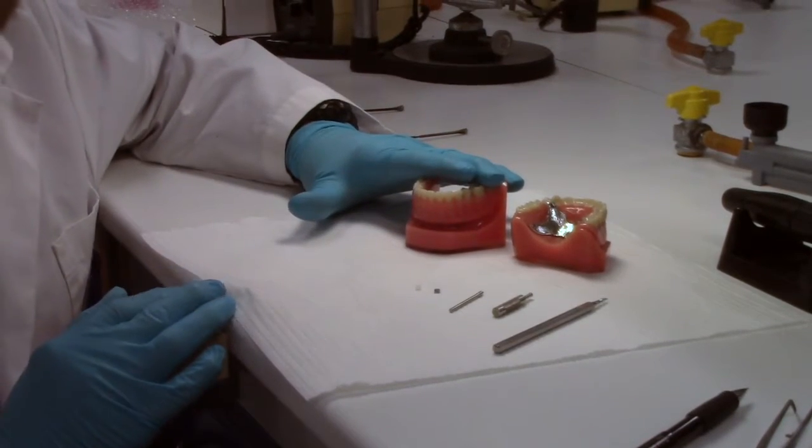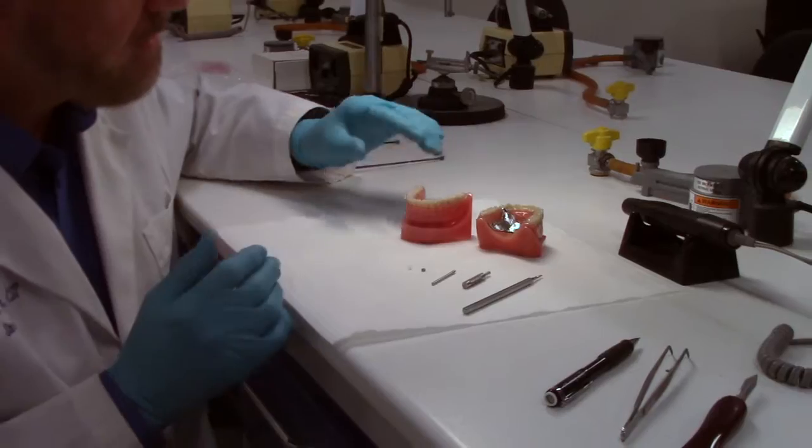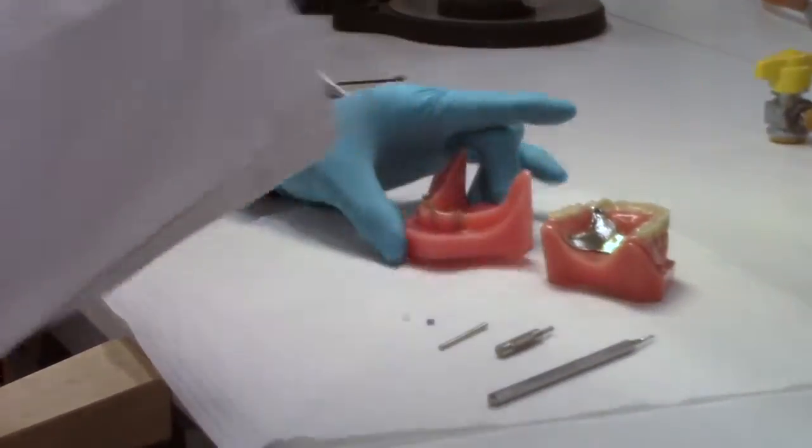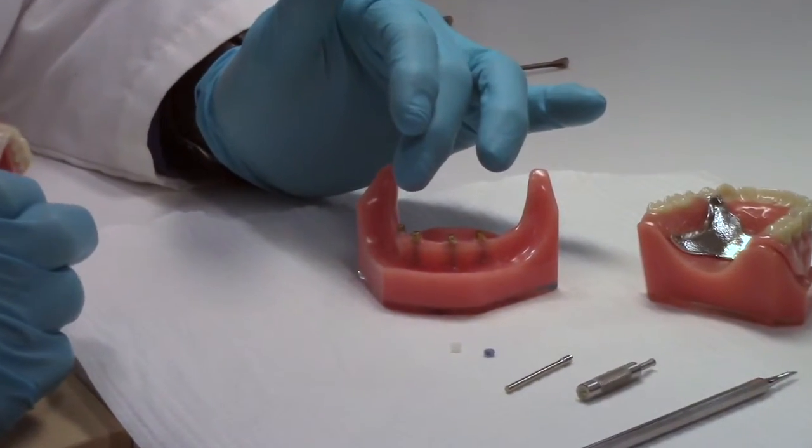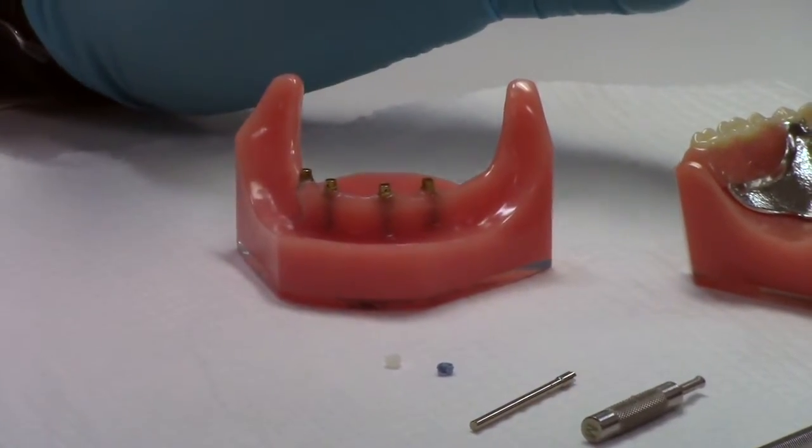Now I have here an overdenture and I've got a partial denture, and I'm going to change out one male from each. So here we see an overdenture version. These could, once again, be on roots, on implants, mini implants. So there's a number of versions.